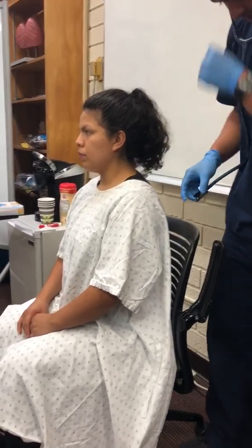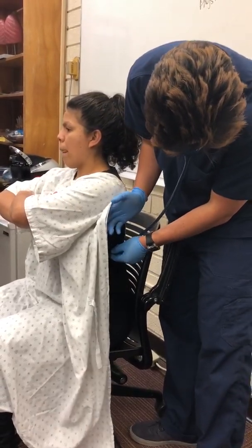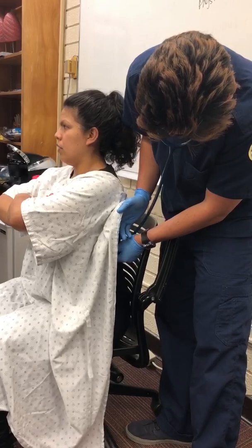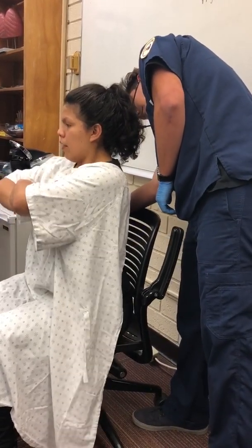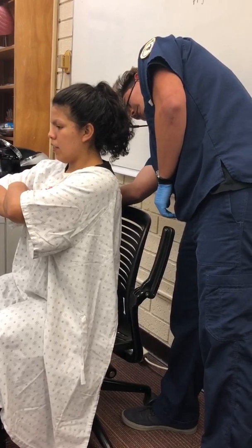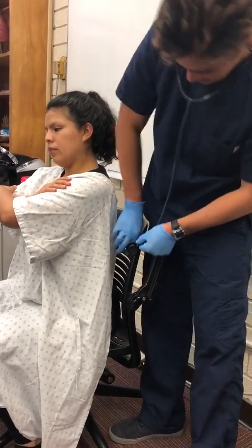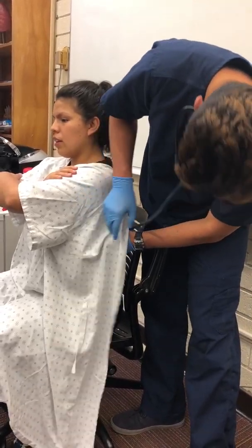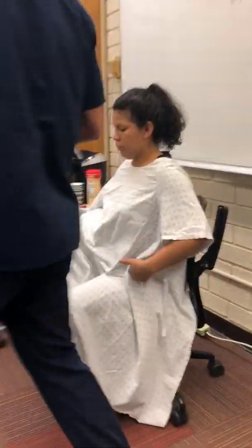Okay, good job. I'm going to take these on your side, in the mid-axillary line. This one closer to your armpit, mid-axillary line. Thank you. Okay, thank you very much. For the front, we're going to do the same thing.